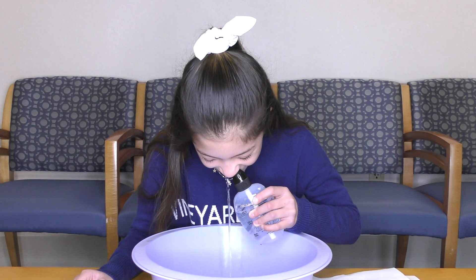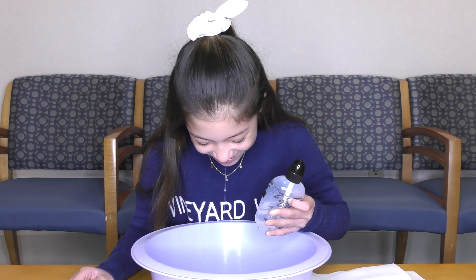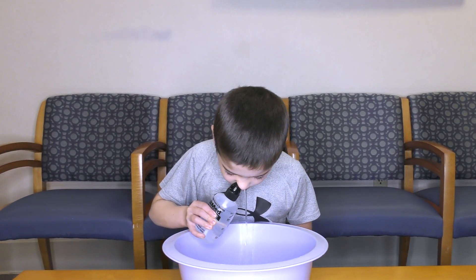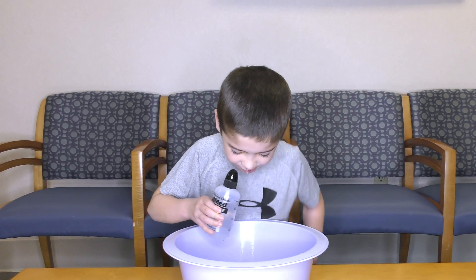Squeeze the bottle gently until the solution starts draining from the opposite nostril. Keep squeezing until you have used about one quarter to one half of the bottle, then blow your nose. Repeat on the other side.